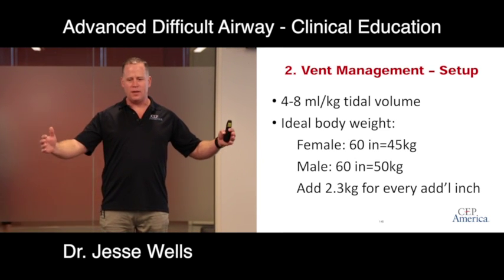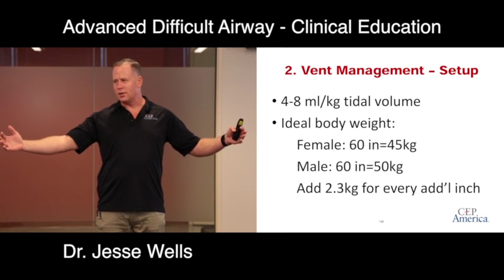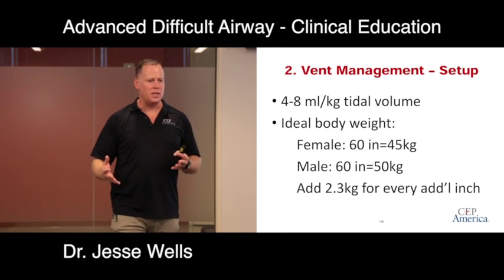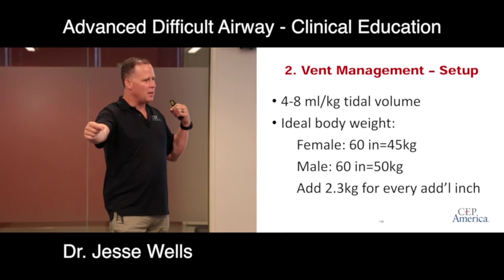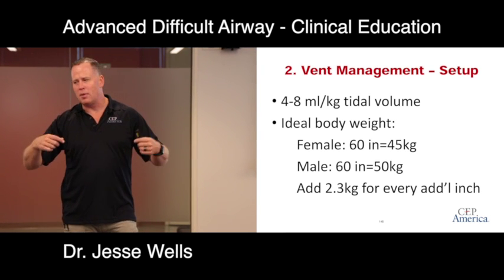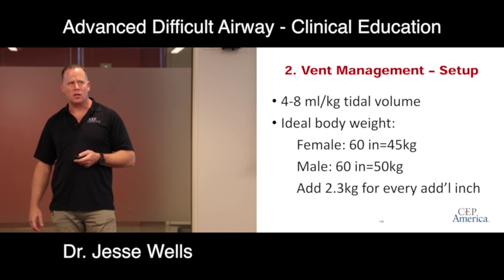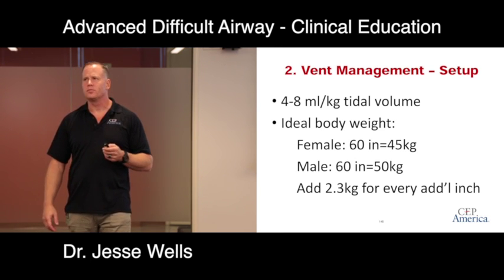I kind of know if their feet are sticking off the end of the gurney, that they're 6'4" or something like that, but otherwise it's hard to tell. Some RTs have tape measures where they actually measure the patient's height, but you want to get a pretty accurate estimate of their height, because that translates into what you're going to set for your tidal volume.